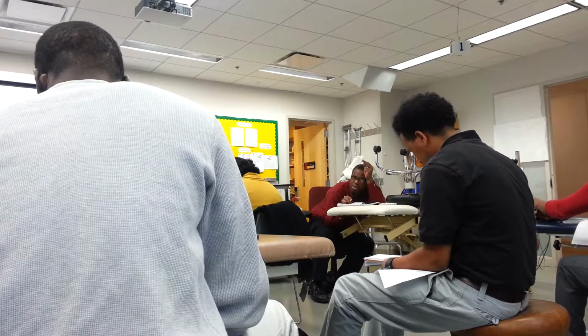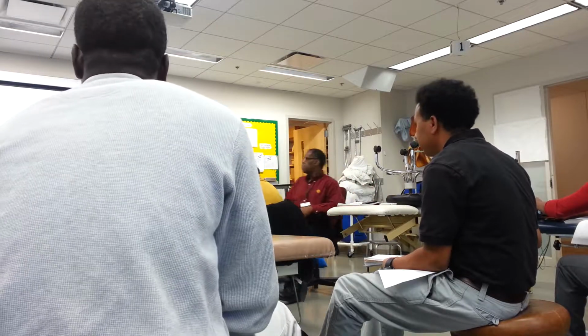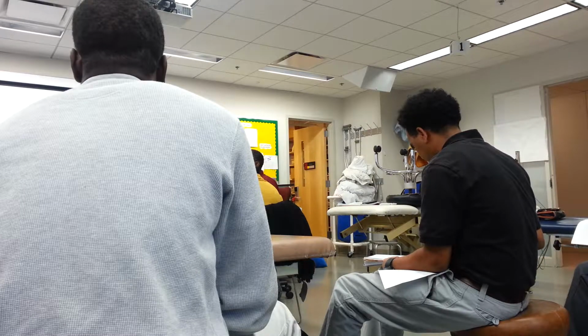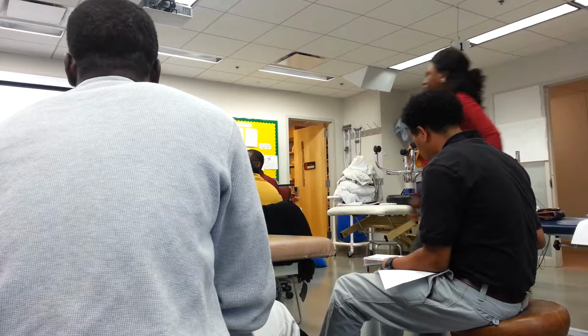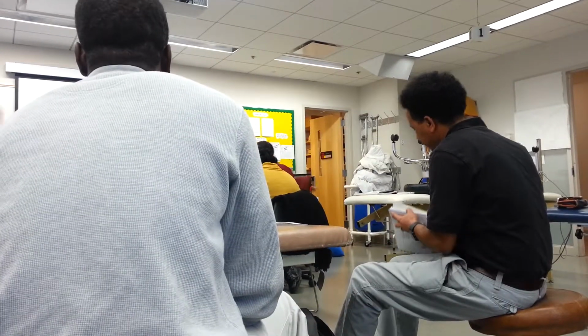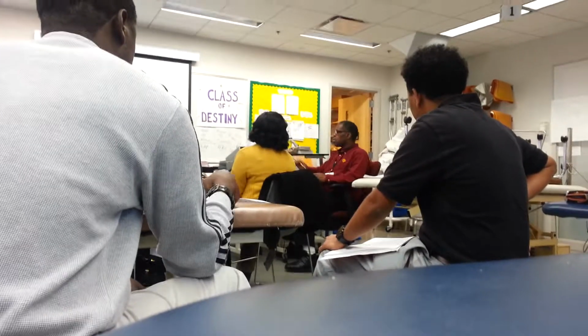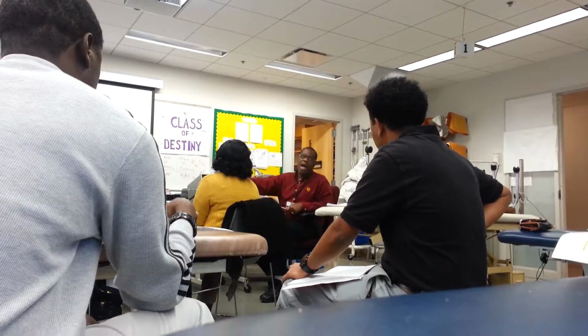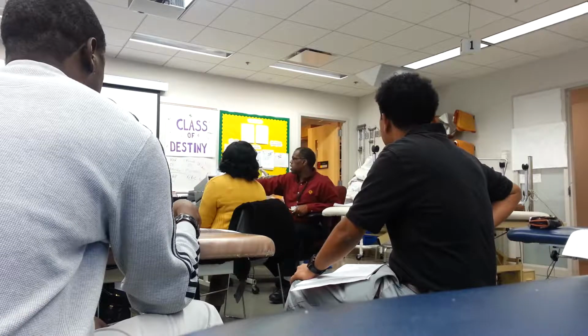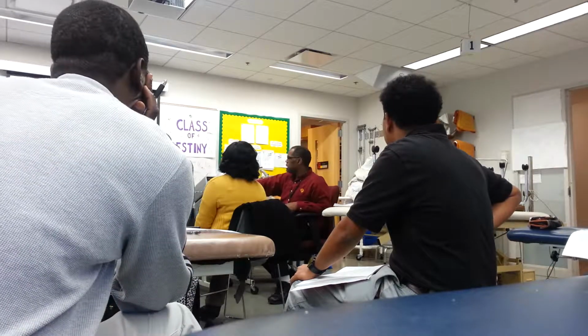If I get a person who has an ulcer on the lateral malleolus, and this is day one, and I want to give them E-Stim, I'm going to choose, if I have it, a monophasic machine. Why? Polarity. What am I going to do with the polarity for this diagnosis? I want to heal. Since I'm dealing with these numbers over here, I'm going to come back to that.